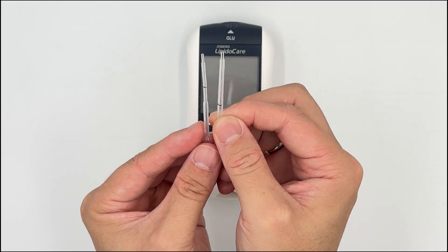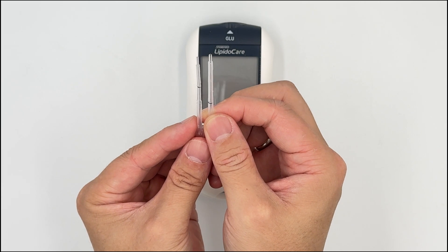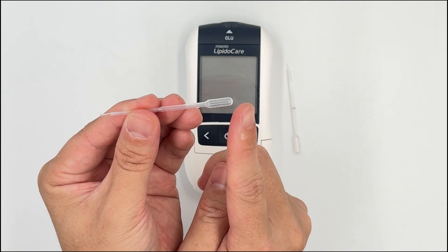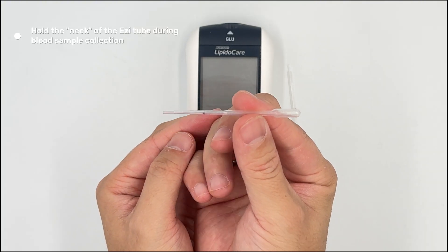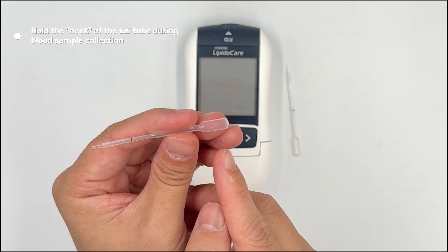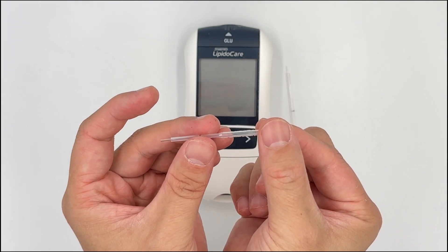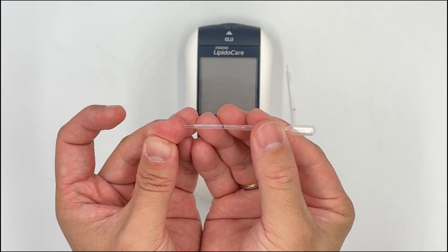Make sure you don't have too much or too little blood. Next, this is very important when using the easy tube: there are two parts — the neck and the head. When taking the sample, make sure you're holding the neck. Do not hold the head, because the head has a hole for suction. If you close this part, you won't be able to suck the blood. So hold the neck during blood collection.